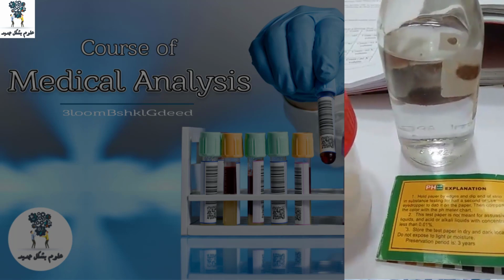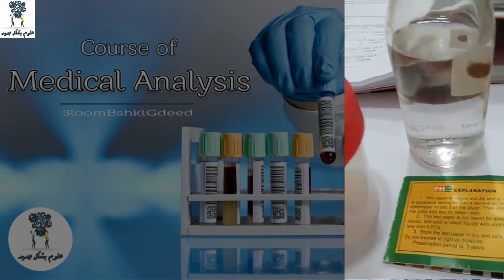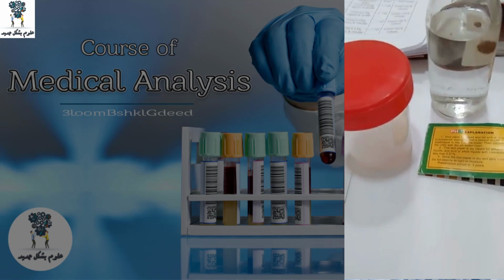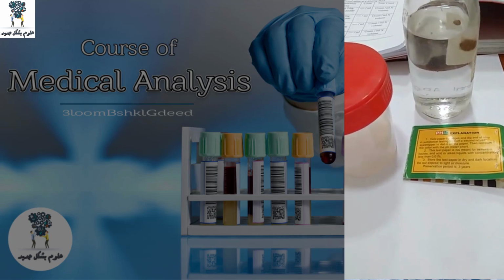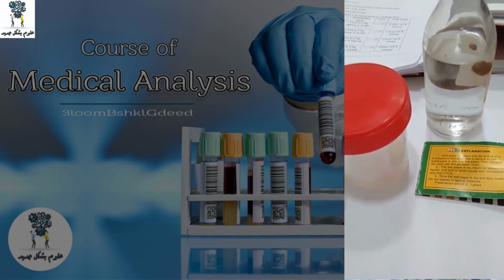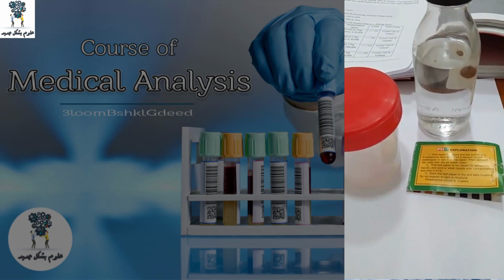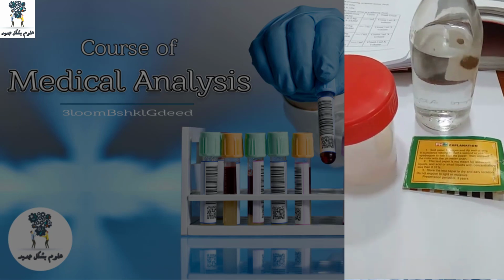Then we will discuss immotile sperm. In this case, we will have a suspicion whether they are live or dead. So in this case, we will do something called a vitality test. What is a vitality test? The vitality test is like an eosin test. Eosin is a pinkish dye. We will use it to stain dead sperms.